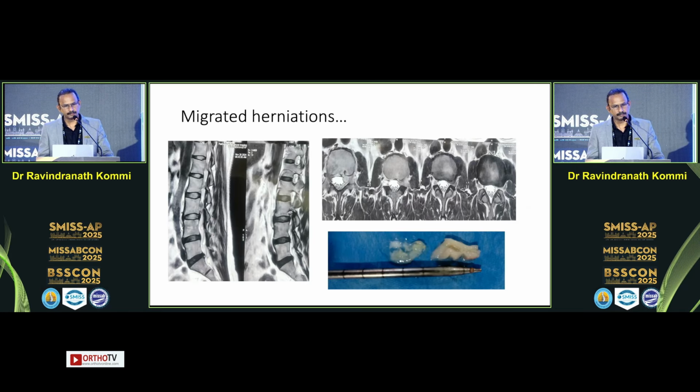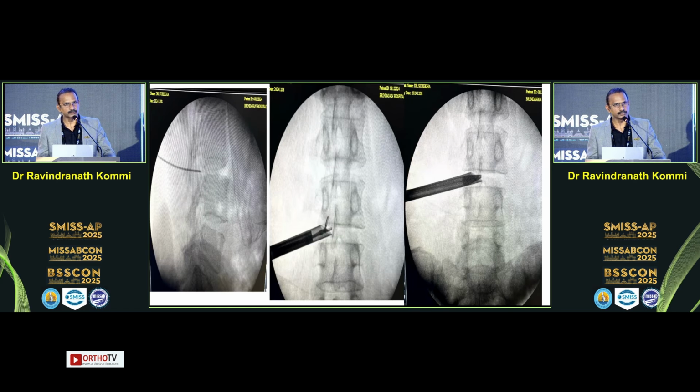Another difficult procedure, I must say, is the migrated herniations. Here is one extraforaminal up-migrated disc herniation at L3-4, and this is a doctor from Bangalore. I did it under local anesthesia, again with the transforaminal approach, and this can be very easily removed. And there are some instruments which help us to do that. A flexible grasper, and of course there is a hook designed by Dr. Gore himself, which helps us in delivering these fragments.